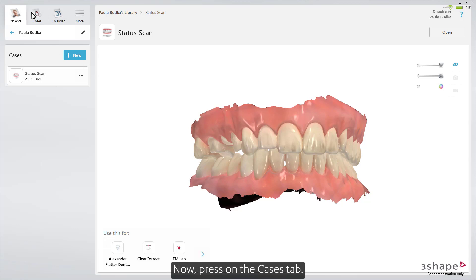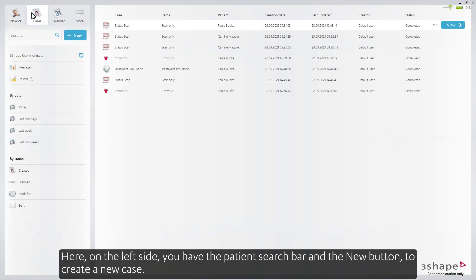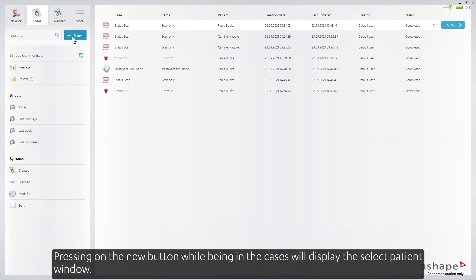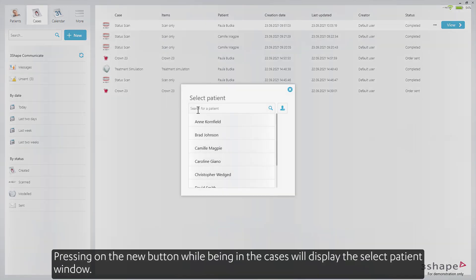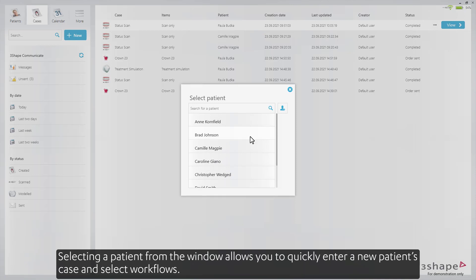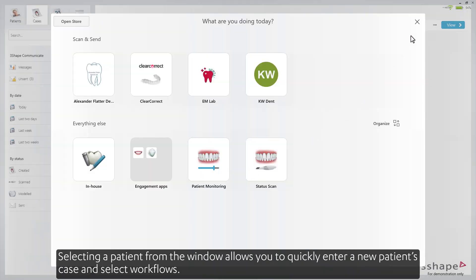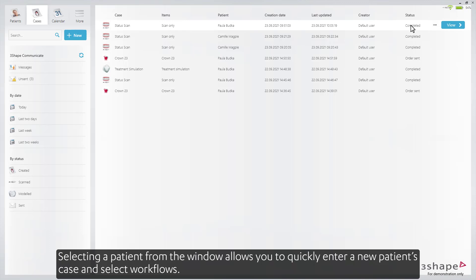Now, press on the Cases tab. Here, on the left side, you have the patient search bar and the New button to create a new case. Pressing the New button while being in the cases will display the Select Patient window. Selecting a patient from the window allows you to quickly enter a new patient's case and select workflows.